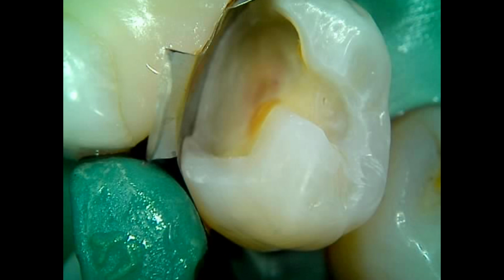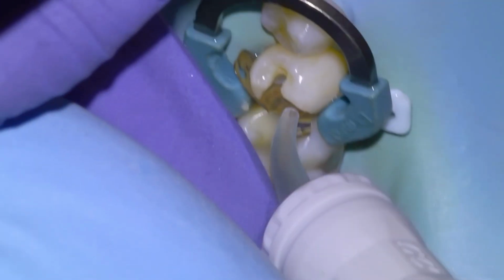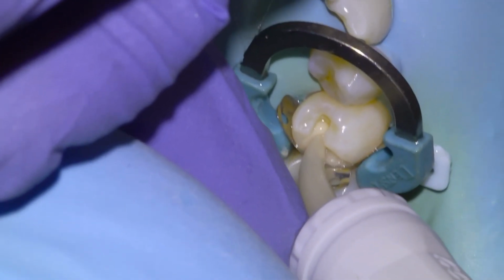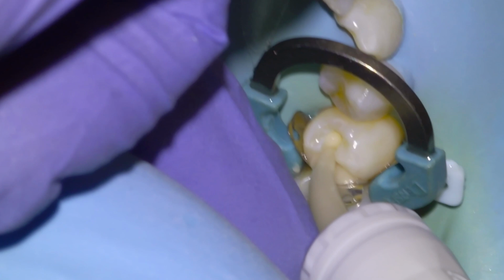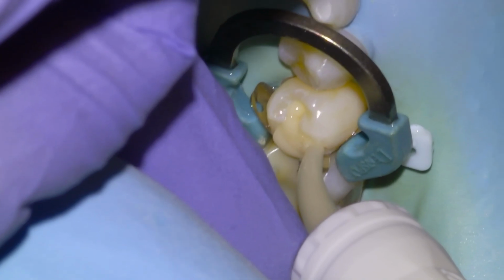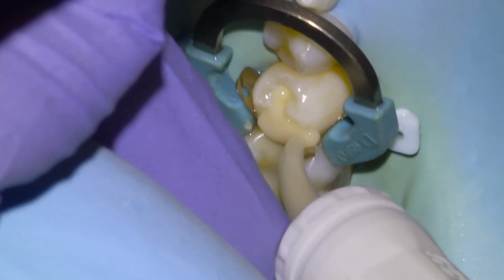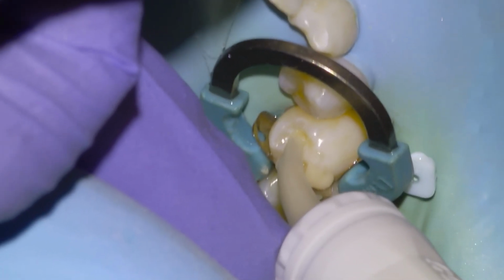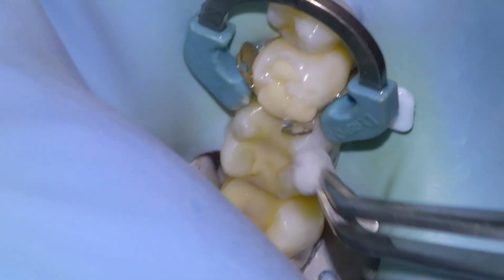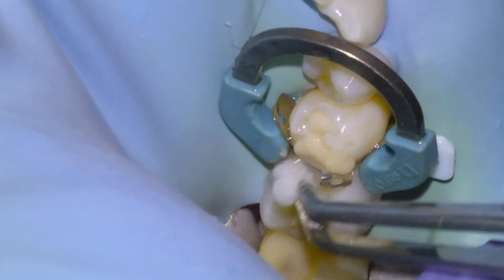There it is matrixed. And we're going to apply our filling material, Equia Forte. Equia Forte works really well in most indications, but especially for deep restorations because it has such a good seal and it's very pulp friendly, I find. So I wouldn't be concerned about symptoms in this tooth developing, and they haven't so far on follow-up. We're going to overfill the prep and then condense the material a bit with a moist cotton pellet to ensure tight adaptation to all the margins.